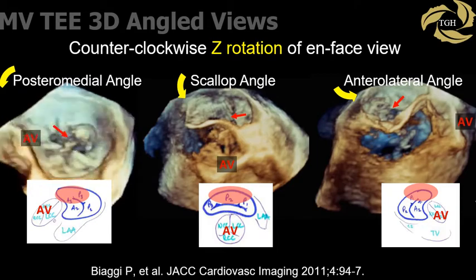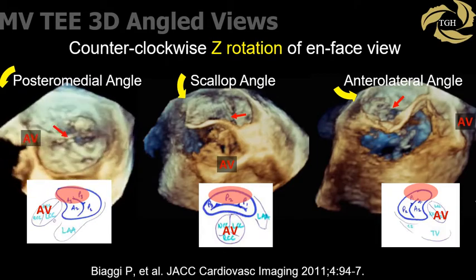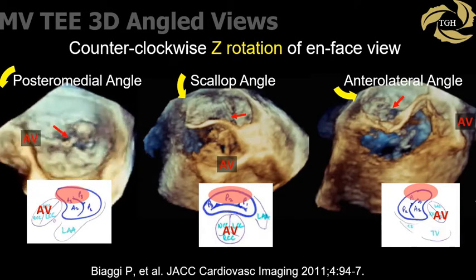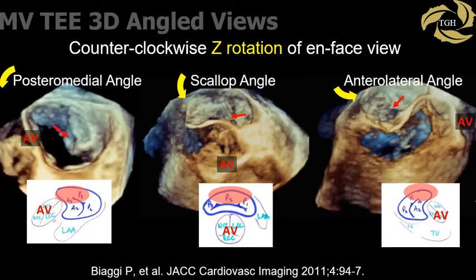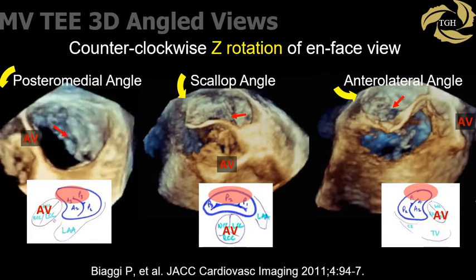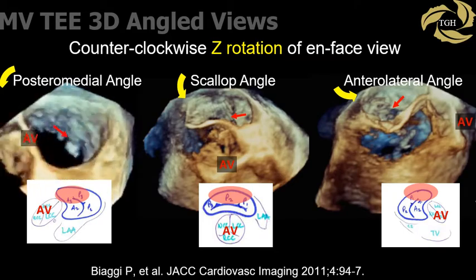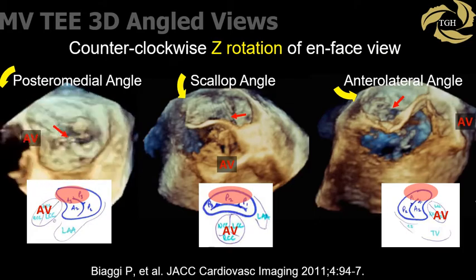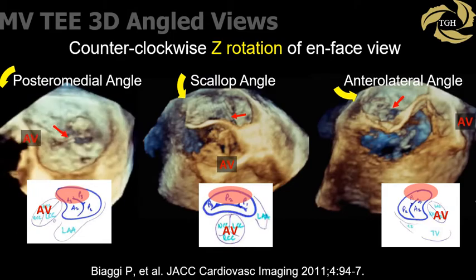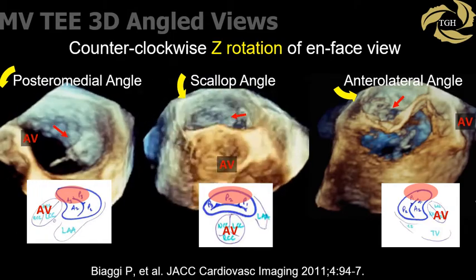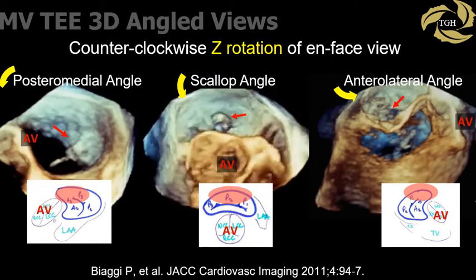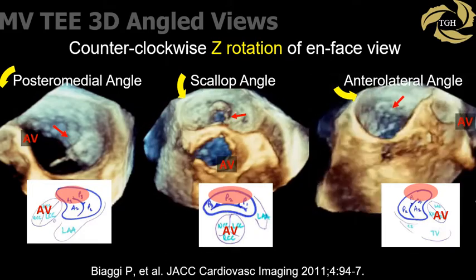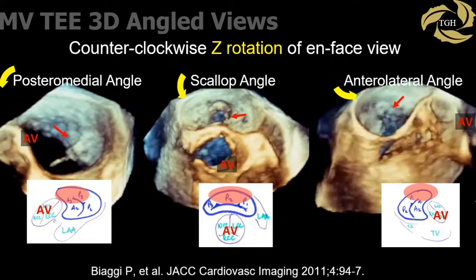Angled views is a simple concept developed at our institution, which involves Z-rotation of the 3D volume from the on-face view through 360 degrees to look at different portions of the mitral valve. This does not use any additional analysis software. Counterclockwise rotation by 90-degree increments shows the posterior commissure, then the scallop view of the posterior leaflet, and finally the anterior commissure.